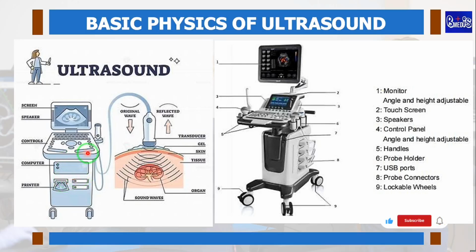Now, that electrical signal travels through the ultrasound cable into the ultrasound probe that contains transducers, which we call piezoelectric materials. Now, these transducers, when they receive electrical signal, they vibrate, and while vibrating, they emit sound energy into the tissue of interest.